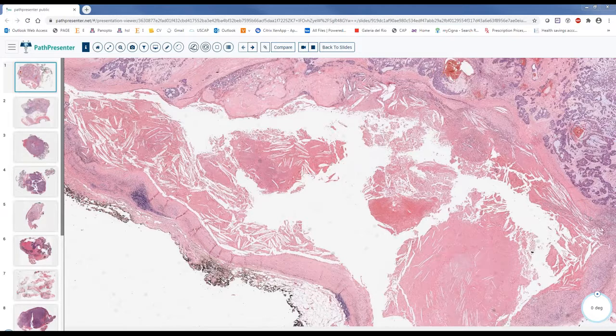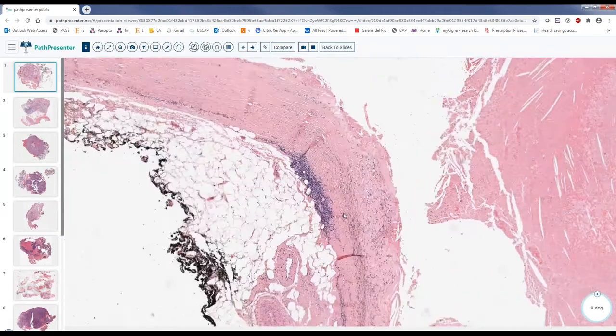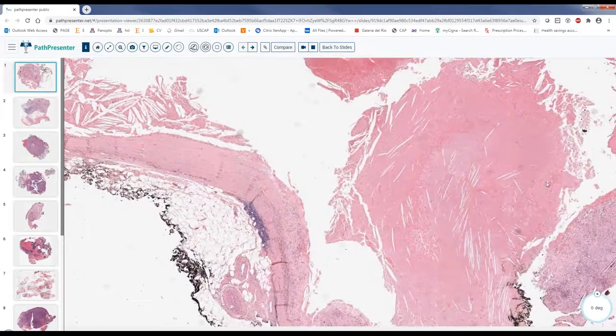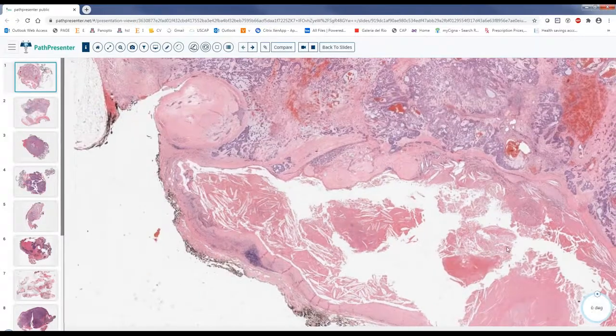The fine needle aspiration findings can affect the lesion. So be careful about this, especially when we see hemosiderin-laden macrophages like here, when you see chronic inflammation, fibrosis, when you see cholesterol clefts. This is what we call cholesterol cleft. So this is probably the lesion having been aspirated before.